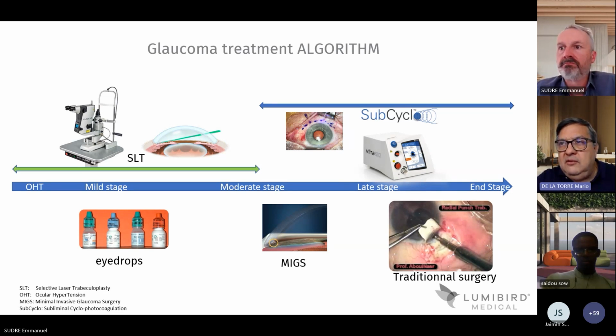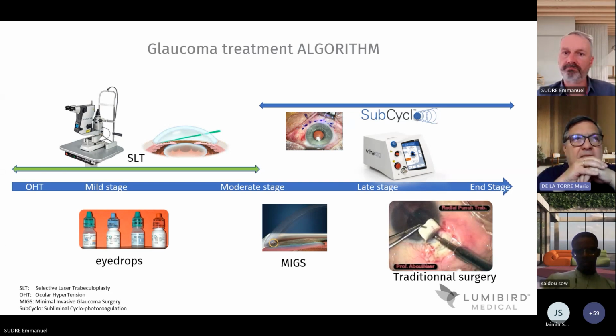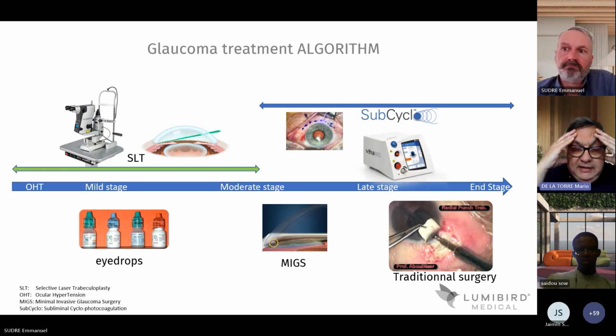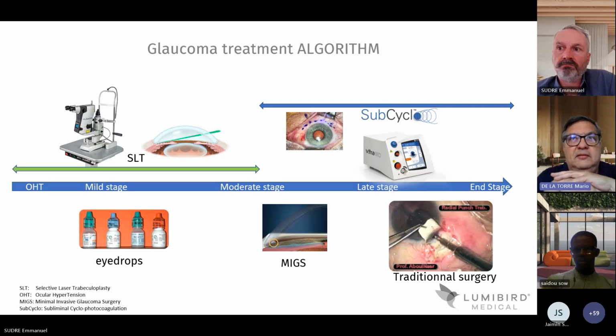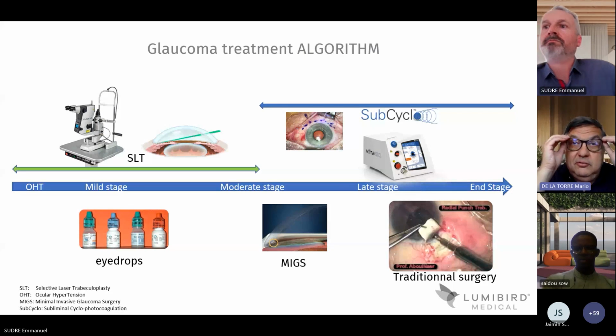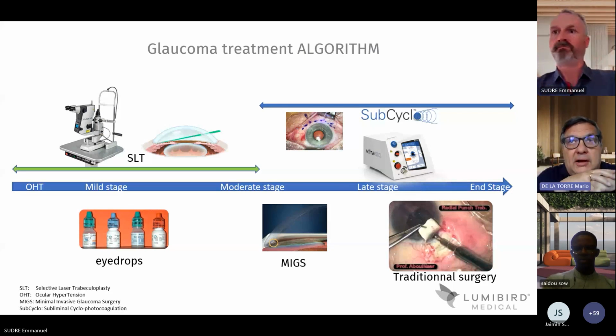The rationale of the treatment is to clean the trabecular meshwork. Normally, everyone has obstructions in a general part of our filtration mechanism over 40 years. It could be very mild or very extensive. The extensive cases develop glaucoma. In the very mild ones, pressure seems to be higher when you are getting older.